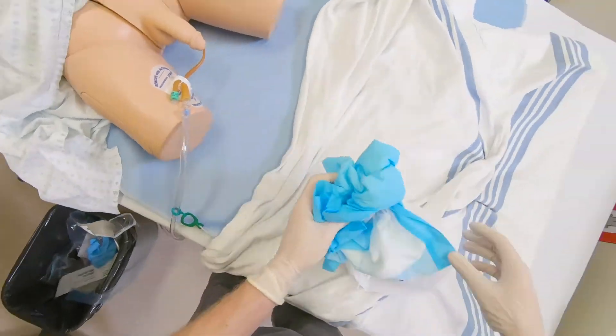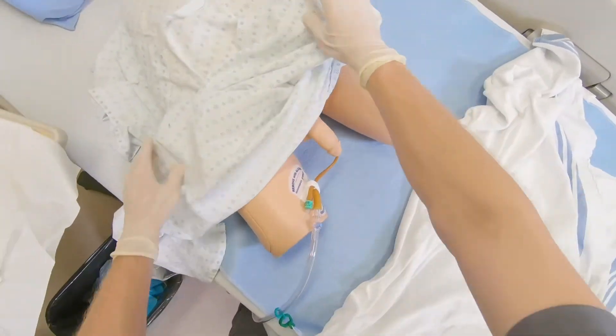Next, cover the patient, discard your gloves, and perform hand hygiene.